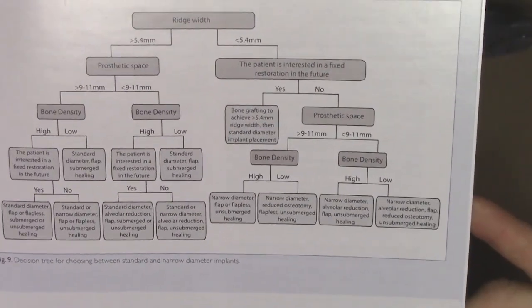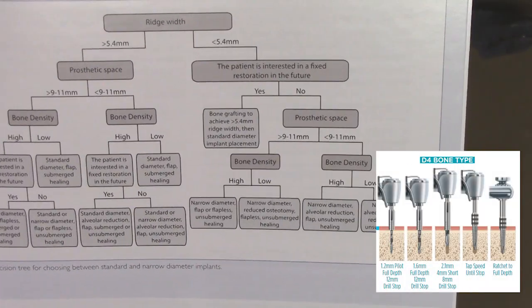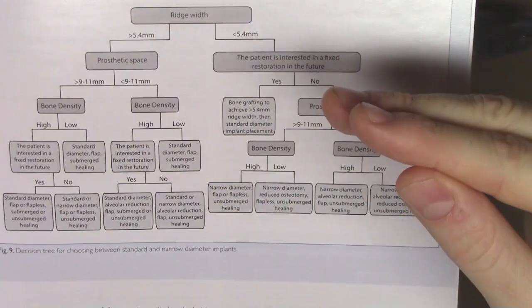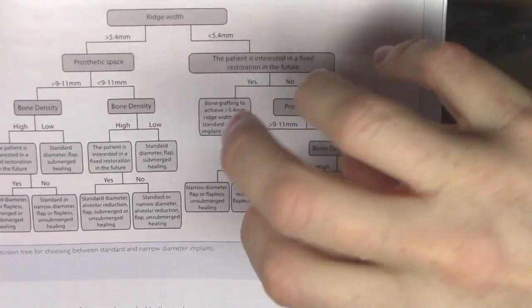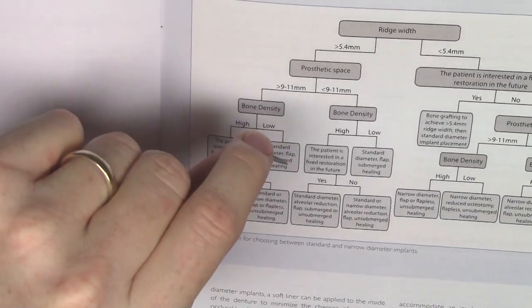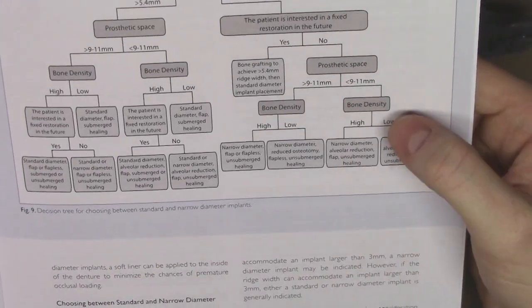What I tend to do with my narrow diameter implants, instead of going through the complete drilling sequence, I skip a drill and use one less, allowing me to insert the implant through the bone with less bone prepared in the osteotomy, so that the aggressive nature of this LODI implant can grab the bone as it's being inserted. It's a very nice feature of the LODI implant.